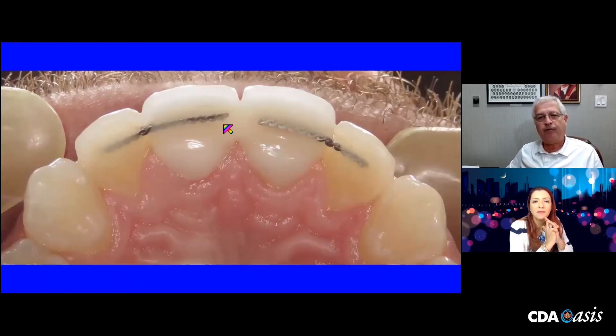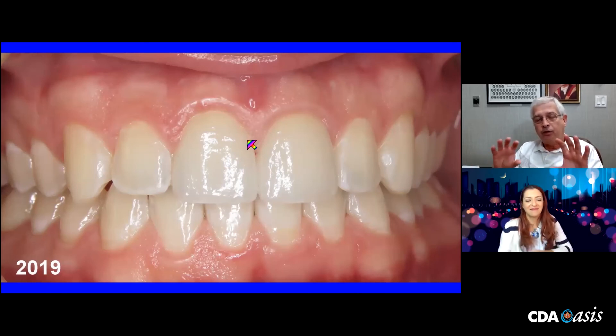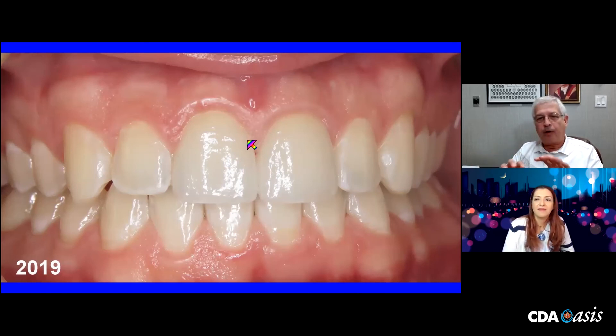So a new set of crowns was made — got a little cleaner and slicker in doing this — and we ended up in 2019 cementing it in. He came in last week and the gentleman is thrilled, and so am I. That's just a neat way to incorporate long-term orthodontic wire retention with crown and bridge work in the anterior.